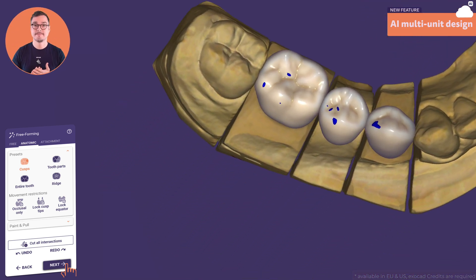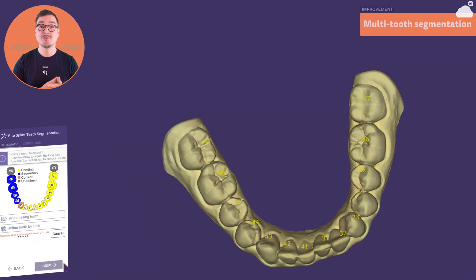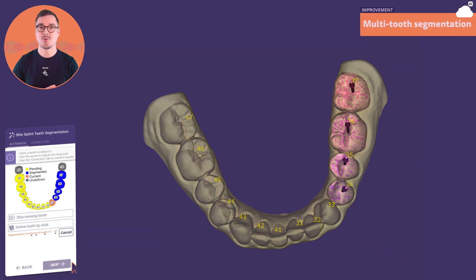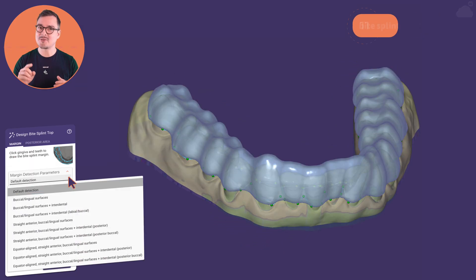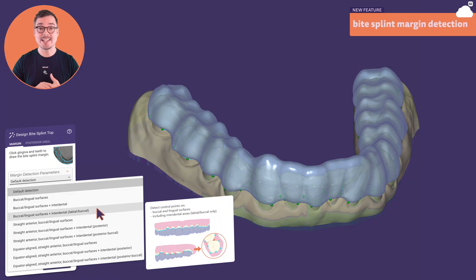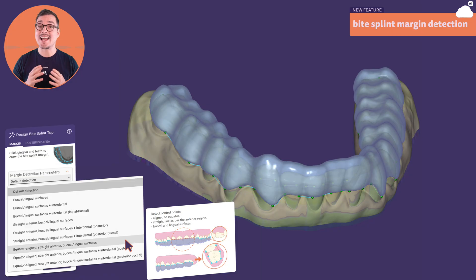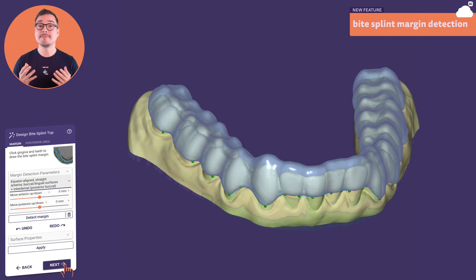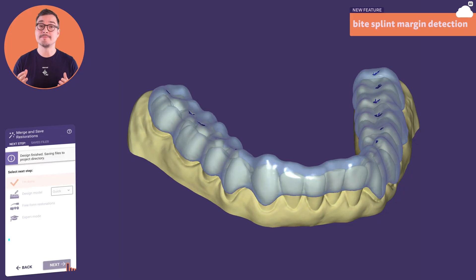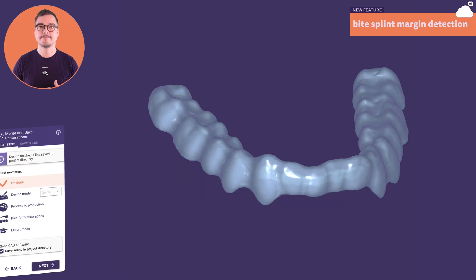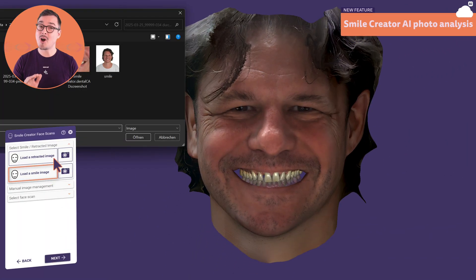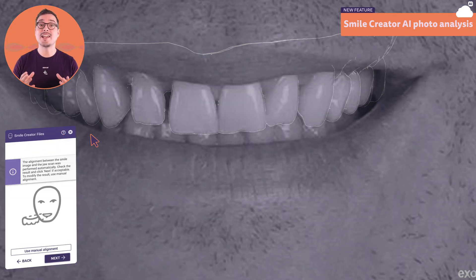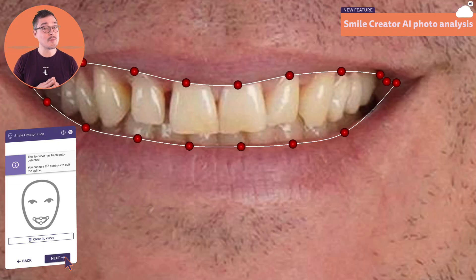The multi-tooth segmentation introduced in 3.2 Elefsina opens the door to a whole range of exciting new features — for example, automatically defining margin lines on bite splints. Now you can customize the detection parameters to match your needs, with animated figures guiding you along the way. For the smile creator, we benefit from more automation thanks to the automatic alignment of the jaw scan and the patient smile image, automated lip line detection, and automatic placement of proportion guides and help lines.